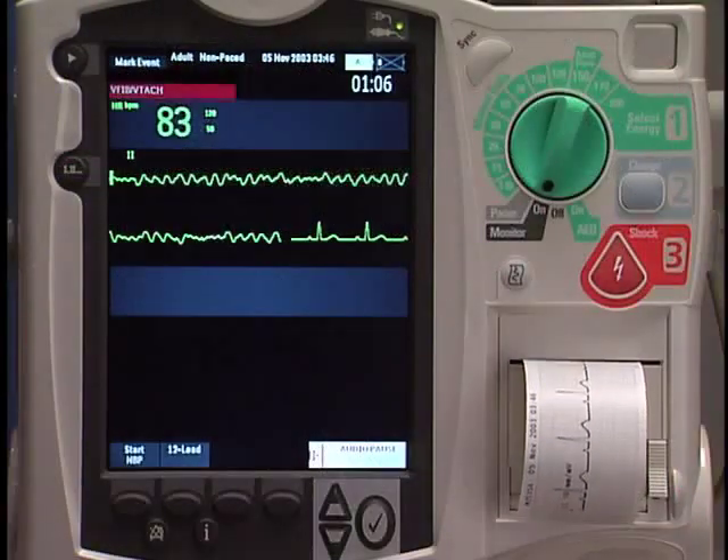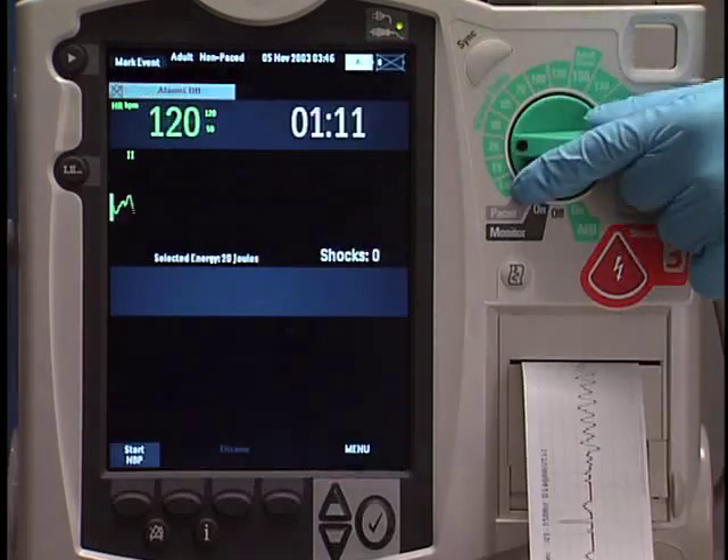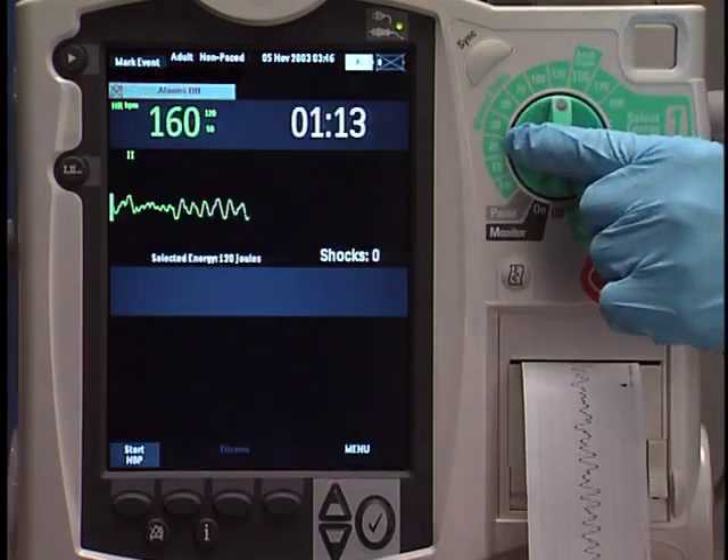After assessing your patient, determining that defibrillation is necessary, and preparing the patient, set the therapy knob to the desired energy.